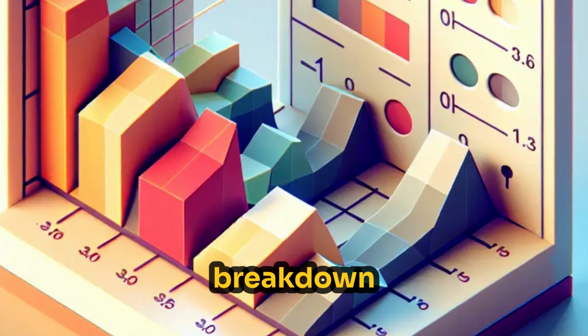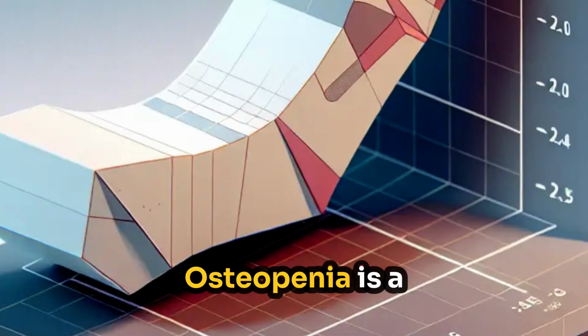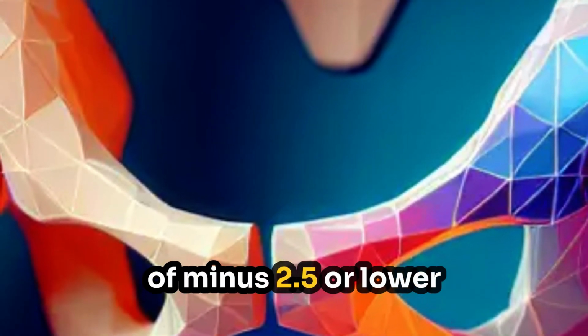Here's the T-score breakdown. Normal is a T-score above -1.0. Osteopenia is a T-score between -1.0 and -2.5. Osteoporosis is a T-score of -2.5 or lower.